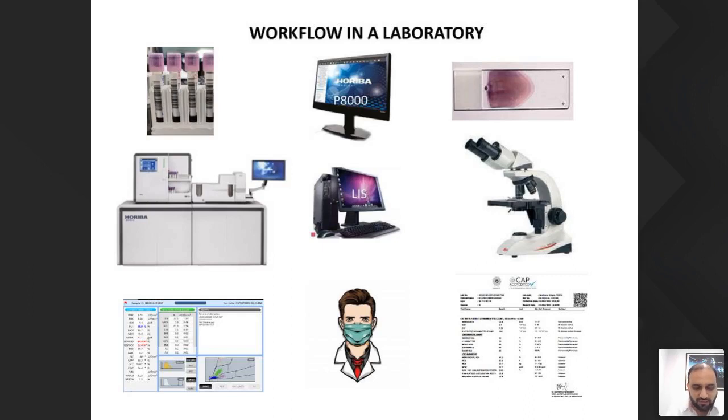So this is a standard workflow, more or less the same in all the labs reporting CBCs. The slide rate depends on the nature of patient that we are catering to. Also, it depends on the type of analyzers that we are using. So an acceptable rate is 10 to 25%. But if you are still in a smaller lab using a three-part analyzer, then almost 100% slides are prepared.